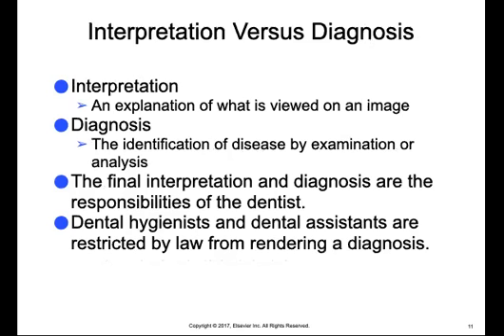So there's a difference between interpretation and diagnosis. In the dental setting, the terms interpretation and diagnosis are often confused. And it's important to note that these terms have very different meanings and should not be used synonymously. Interpretation refers to the explanation of what is viewed on a dental image, whereas diagnosis refers to the identification of disease by examination or analysis.